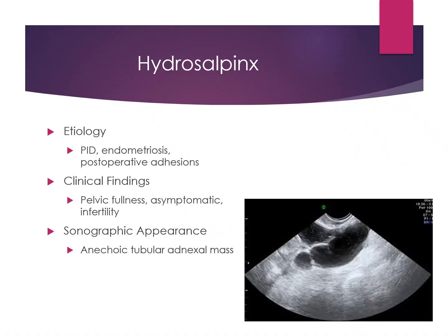So much like when we have pelvic inflammatory disease, we can just have fluid inside of the fallopian tube, most likely from a tubal ligation or endometriosis. Again, pelvic inflammatory disease can give us some fluid in those fallopian tubes. They may have pain or fullness in their abdomen, and we're going to see that muscle man appearance, that tubular structure filled with fluid inside of the pelvic area.